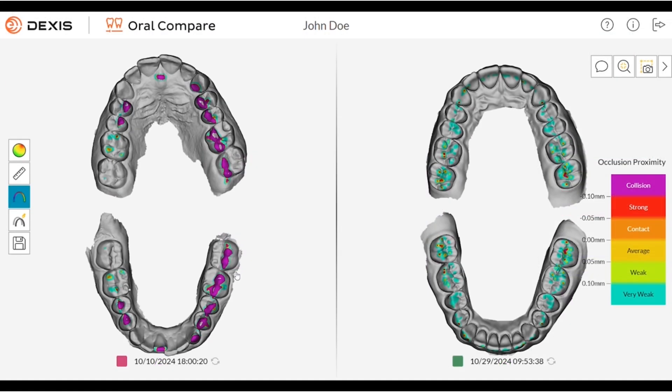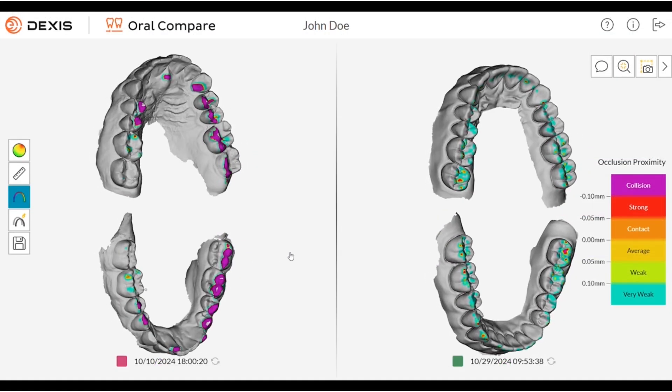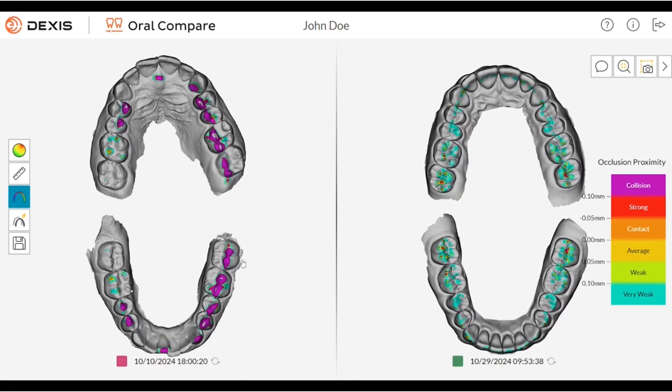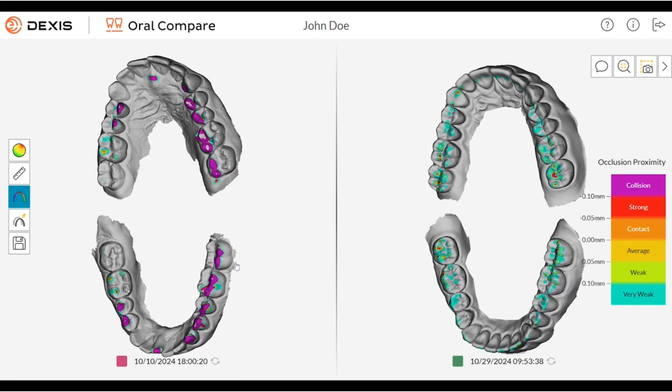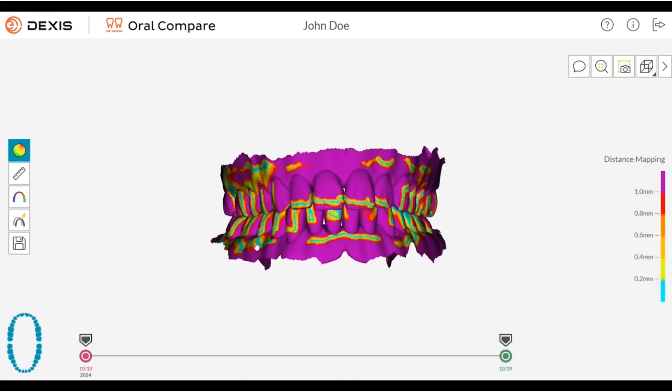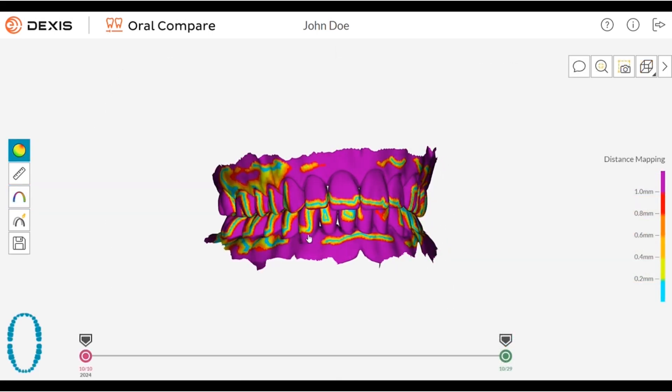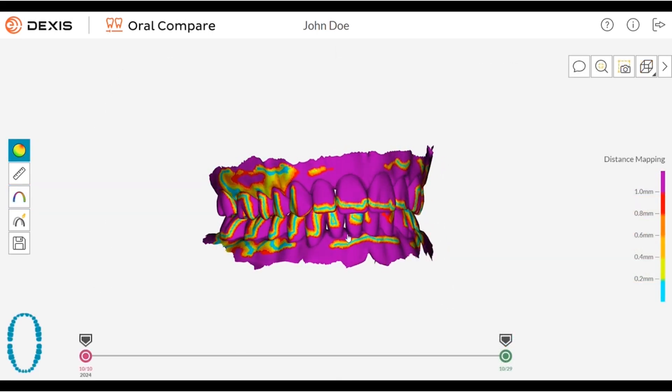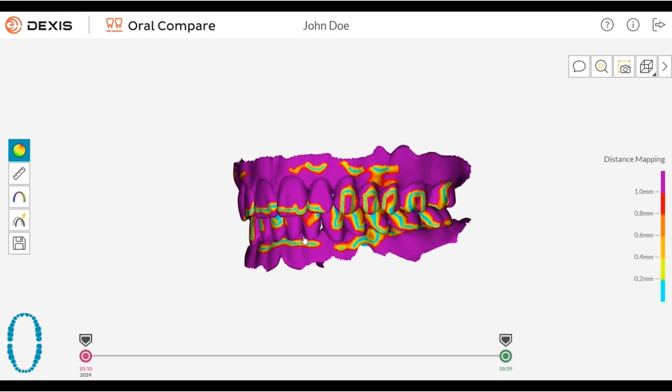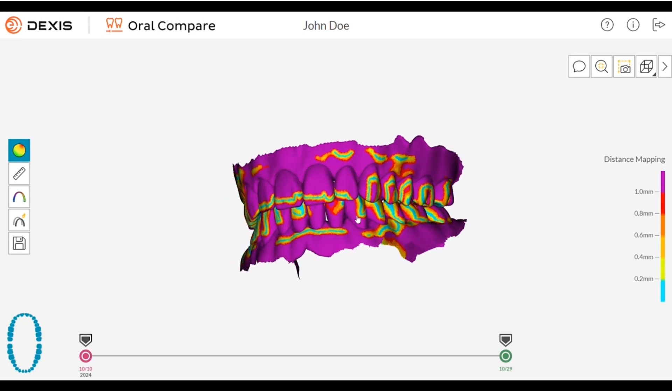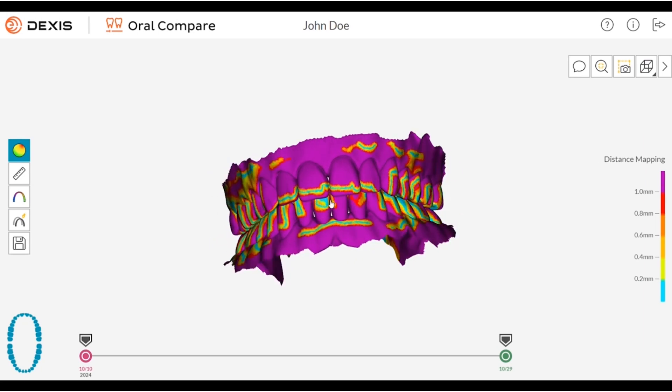Display occlusion maps of two scans side-by-side to detect and evaluate changes in occlusion. The automatic color-coded distance map can help doctors to visualize bruxism, enamel loss, and gingival recession over time.